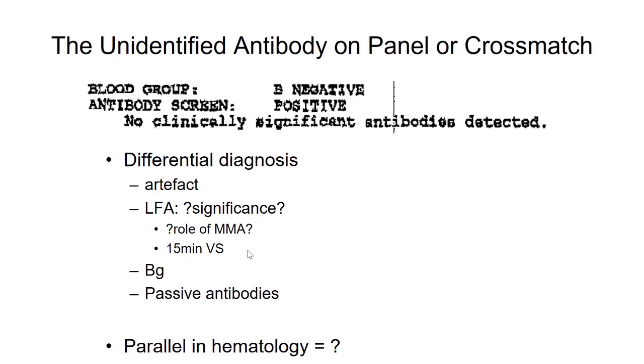The vital signs done at 15 minutes, par for the CSA standards, will also be a clue. This is, in essence, a test of in vivo compatibility. In the first 15 minutes, you're not transfusing a lot of blood. If you're giving that test dose at a rate of 50 mils per hour, and you're checking in at the 15-minute point, you can't have infused more than 12.5 cc's minus a bit of dead space.